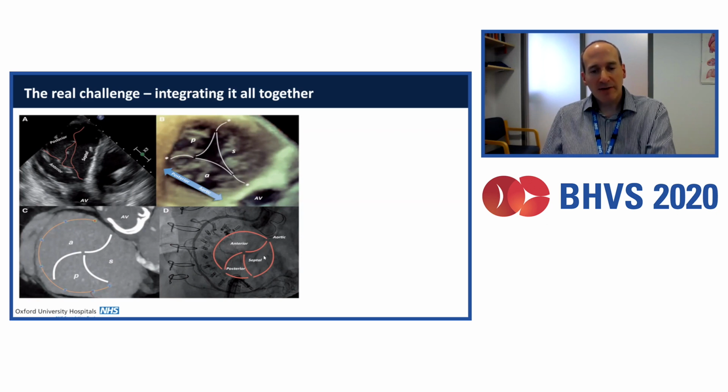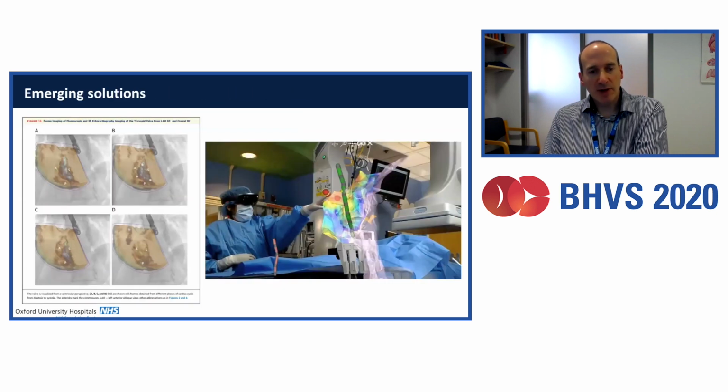and the tricuspid leaflets, which of course can't be seen, is in truth an enormous challenge and takes lots of practice and takes very close collaboration and agreement between the person providing the live imaging and the interventionist to make sure you're speaking the same language, you're talking about the same structures, and you're orientating your views in an organized and collaborative way. Technology might help us all.